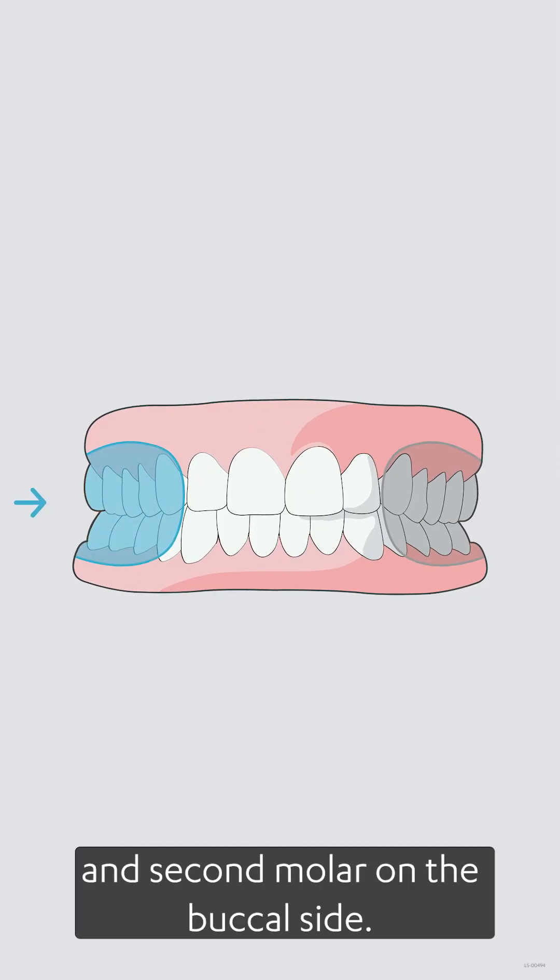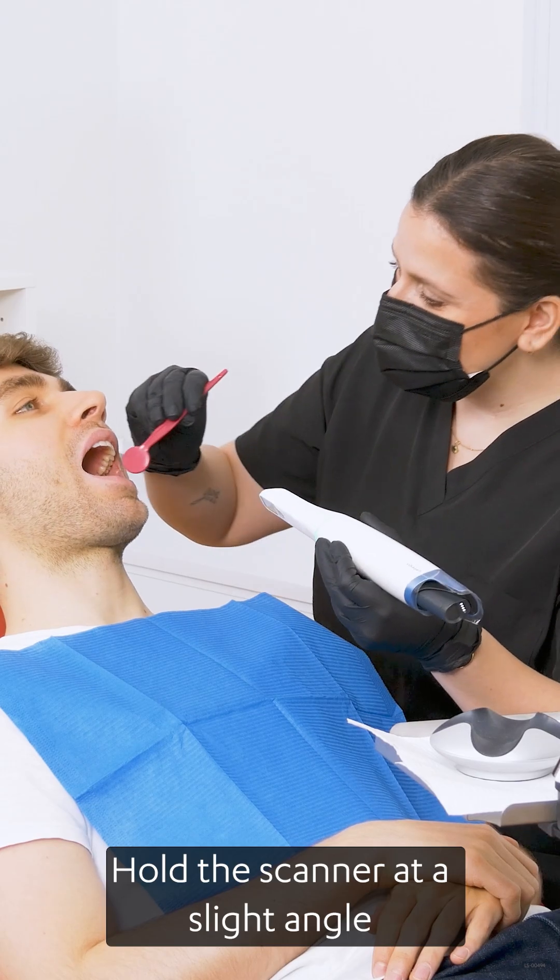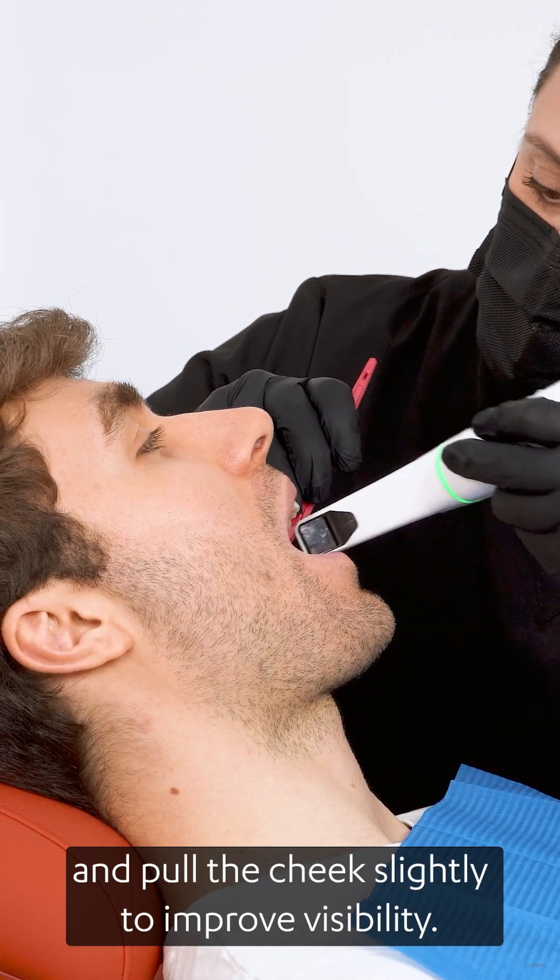Position the scanner between the first and second molar on the buccal side. Hold the scanner at a slight angle and pull the cheek slightly to improve visibility.